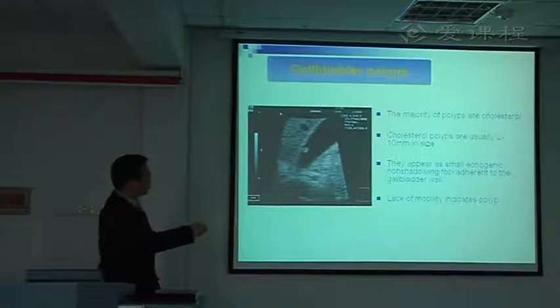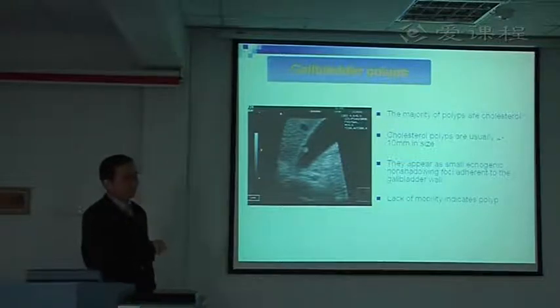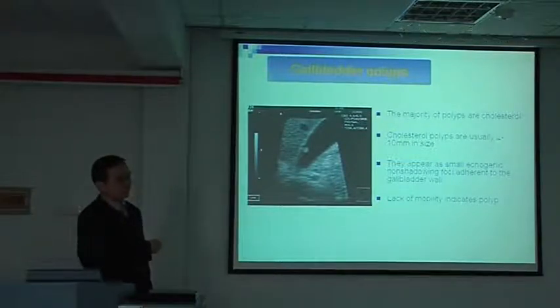It cannot move this way. Yeah, these are good, right? These are within the gallbladder, right? This polyp is within the gallbladder, right? Yes. And the polyps that would be outside the gallbladder can be adeno, whatever you're saying, right? Adenomyomatosis.